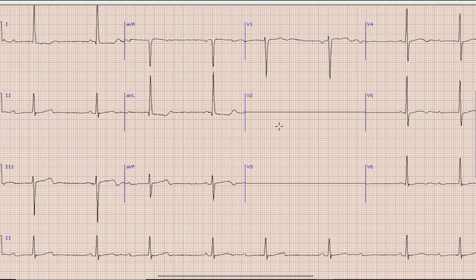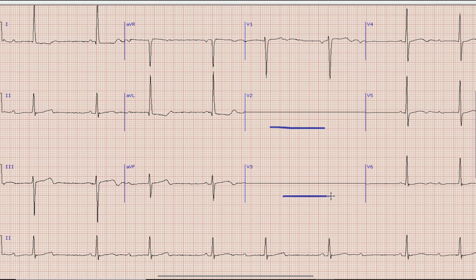The first thing we can appreciate clearly on this ECG strip is the absence of lead V2 and V3, which means we cannot completely interpret this ECG as we don't have lead V2 and V3. But still we can find plenty of information on this ECG strip.